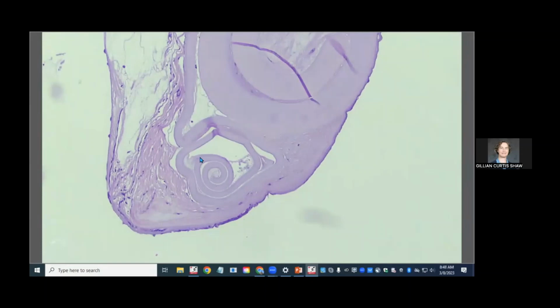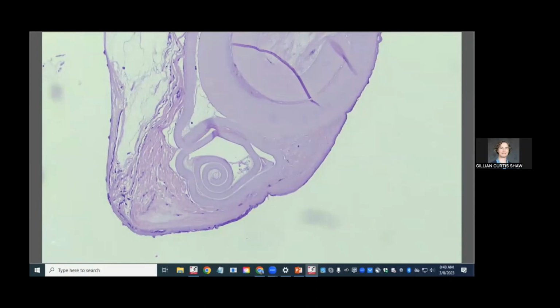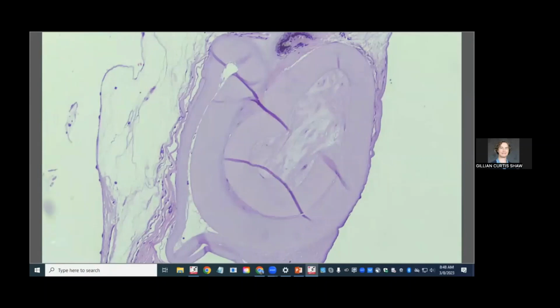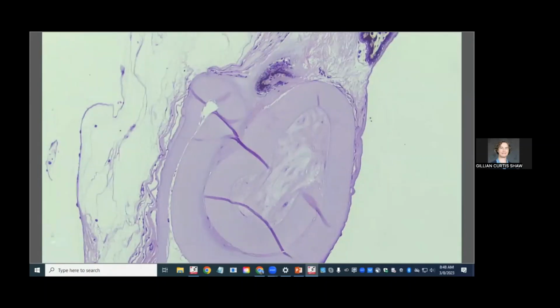So this is a folded lens capsule. We can see the posterior lens capsule here, which is thinner, and it develops this lovely little tight curl. You can think of it like piano wire under tension when it finally snaps, like in cartoons, where it curls back like a little curl like that. So this is a true lens capsule rupture. We hardly need proof of that, but that is what it looks like.